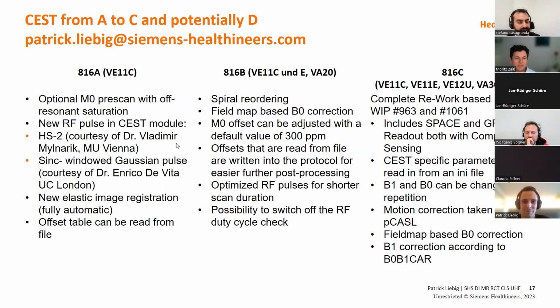All right, then maybe two more questions, and then we leave you to your holidays, Patrick. One is a question about compressed sensing. Jinwan Zhu asks, for compressed sensing factor 8 and 10, how good are they? This is quite going to the limit. Exactly, 8 and 10 is roughly the limit.